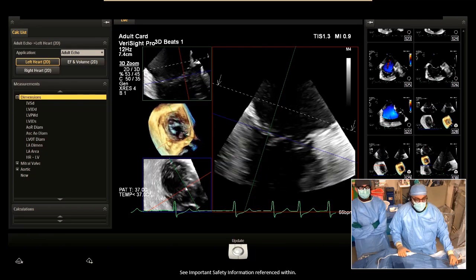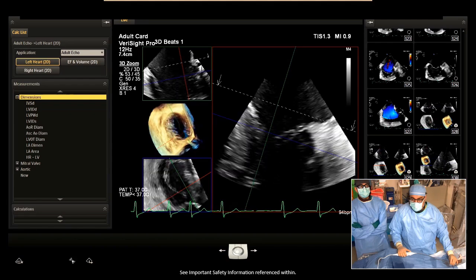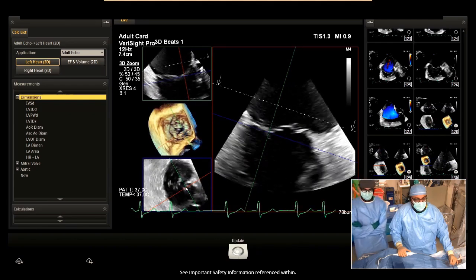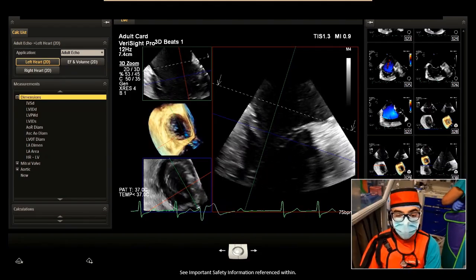I mean, it might just be this, right? It might just be +45 based on what we're seeing here. Yeah, it looks like if we go to +45 alone, or if you go to -45, we can just do MPR if you like. So I think any of these techniques will work well, Gagan. Yeah, so let's do this. Let's go back to 0.